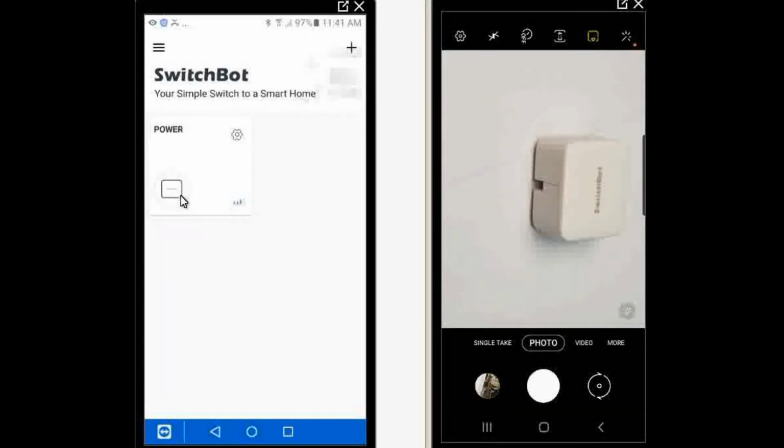I'll do it again so you can see what it looks like. And of course that first failure was due to the connection between the SwitchBot unit and the autorefractor being an initial first time connection and not working. But after a few times, if I do it again, you'll see that it'll work properly. There you go. So now you have the SwitchBot application connected to the SwitchBot switch, which is controlling 4 different elements: right, left, start, power, and print buttons on the autorefractor.